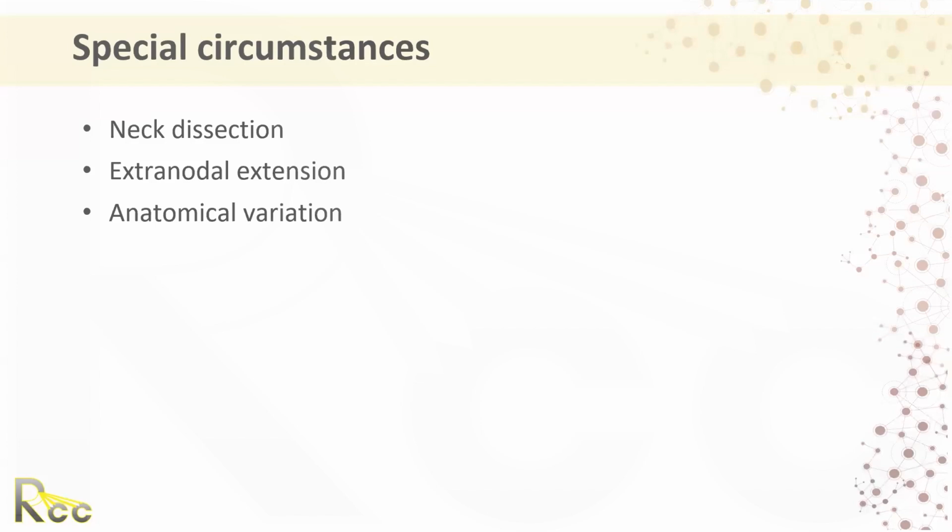Thank you, Dr. Patel. Also, another question. I know some people in the US treat the superior part of the head with IMRT and they use the lower part with electron. Do you have any comments about that? Do you use it that way or just perform IMRT for the whole neck? We go IMRT the whole neck. Again, I think there were some institutions doing that split treatment trying to really reduce dose to the larynx and the midline structures with the block.